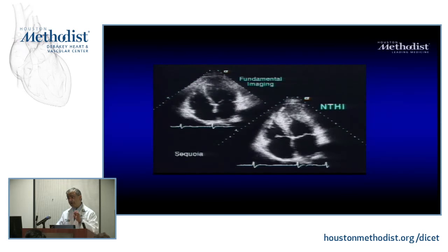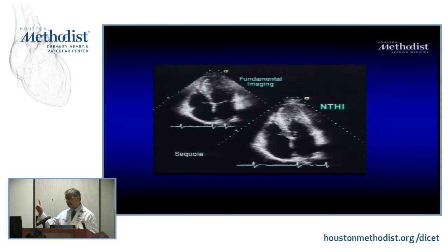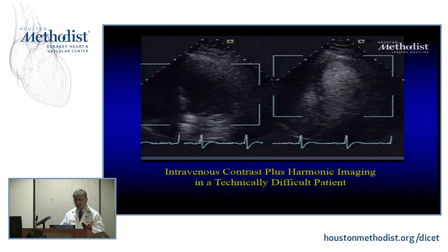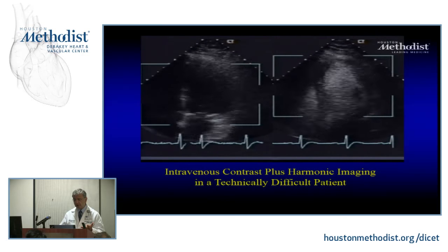And the astute sonographer would go back to fundamental at a high frequency if there is something funny, if there's something maybe too thick for you to be able to assess. And that's why I think it's important for you to know. Obviously, the major application is contrast, okay? So without contrast, with contrast, now with harmonic.